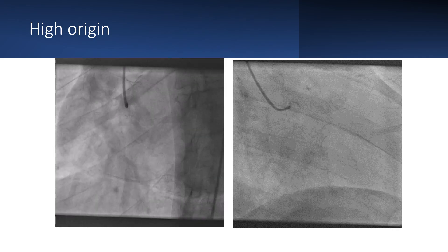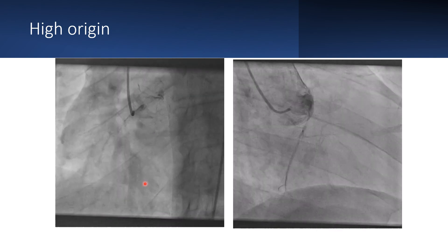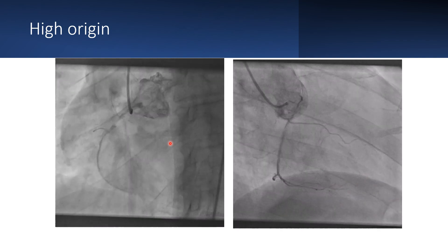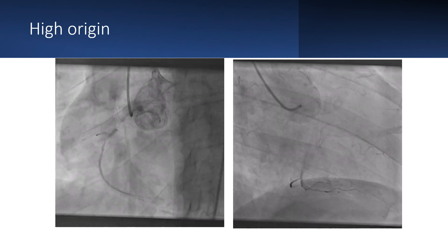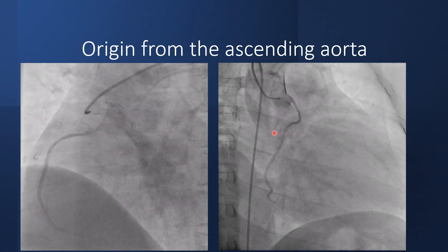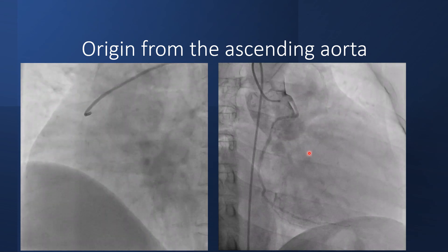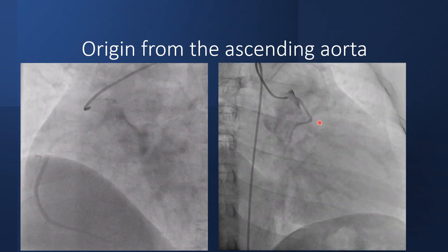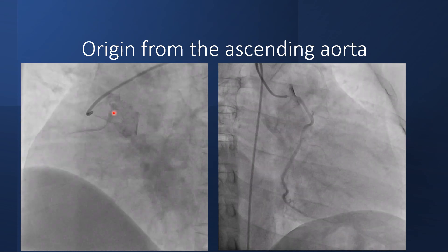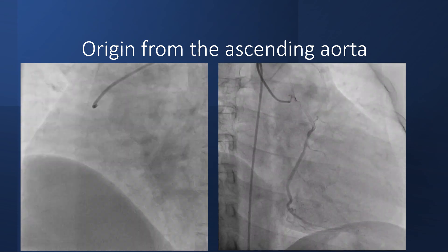Another anomaly is a high origin of the RCA. In this case, the RCA is arising from the sinus of Valsalva but from its upper part. This next case shows the RCA arising from the ascending aorta, not from the sinus of Valsalva. Here is the sinotubular junction and here is the RCA from the ascending aorta — these are the sinuses and the RCA is arising from the ascending aorta.